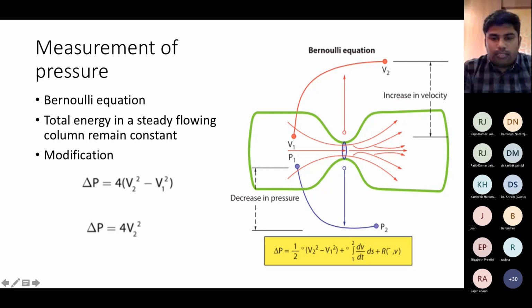The Bernoulli's equation has 3 components. One is the convective acceleration, another is the linear acceleration or flow acceleration, and another is the viscous friction. The flow acceleration at the peak velocity is negligible. This can be ruled out. Whenever the hematocrit is less than 60%, the resistance is also negligible. Substituting values for the density of the blood and correcting for the units, we get the value 4.